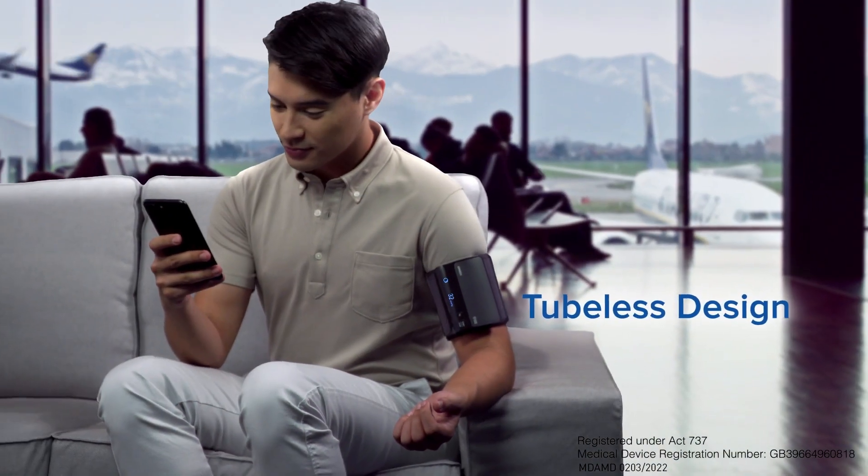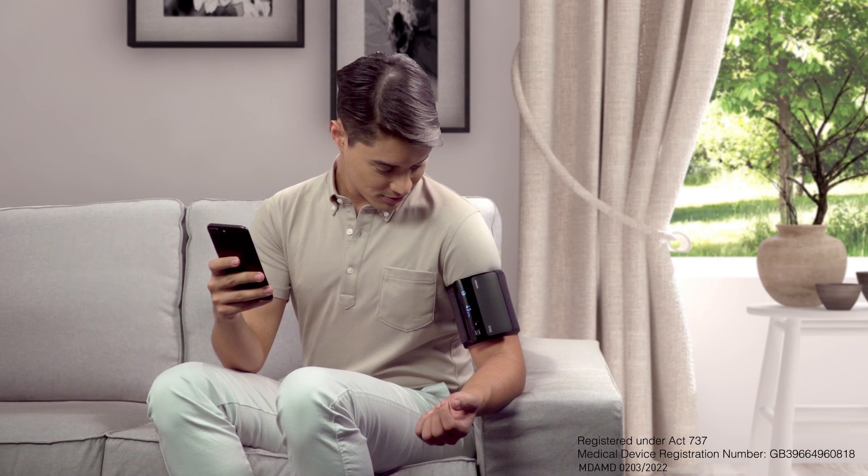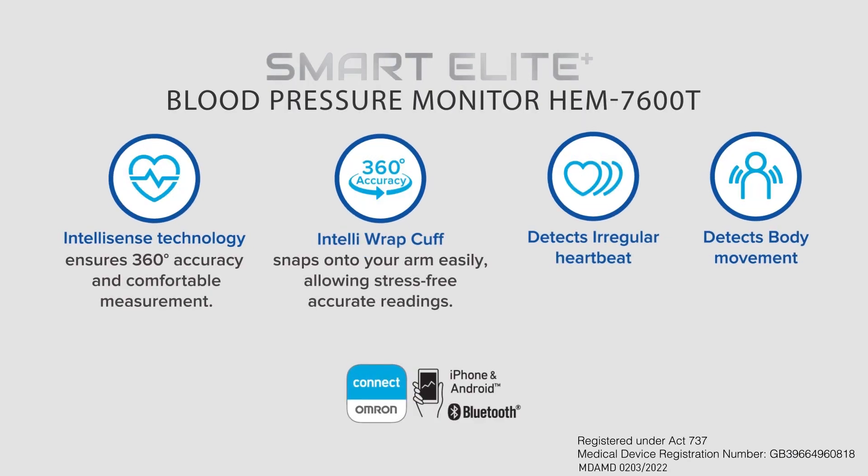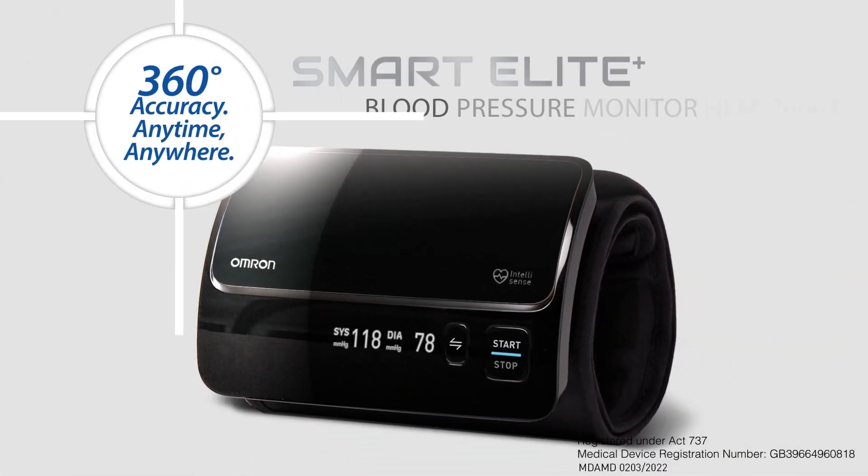Portable and easy to use with its tubeless design, you can monitor your heart health anytime, anywhere. Empower your health. Get 360 degrees smart.